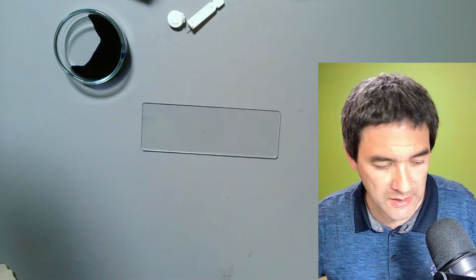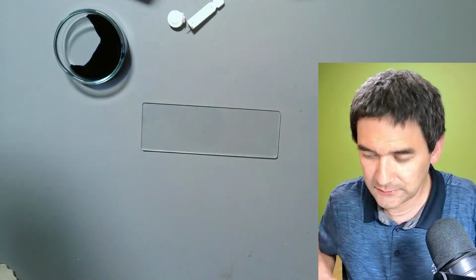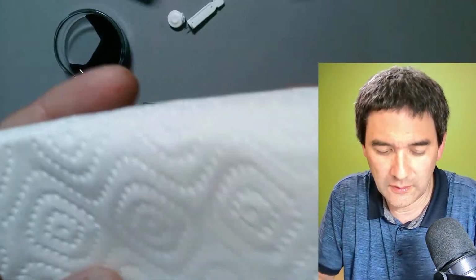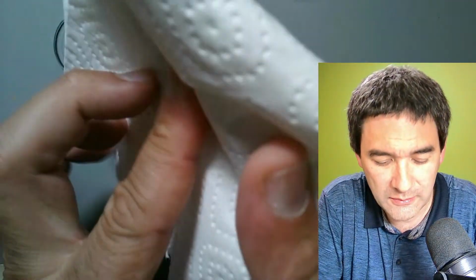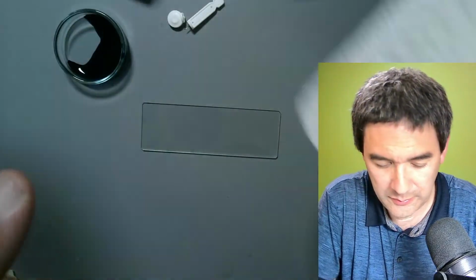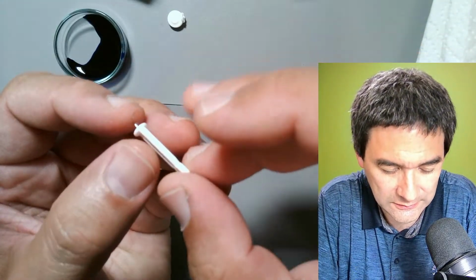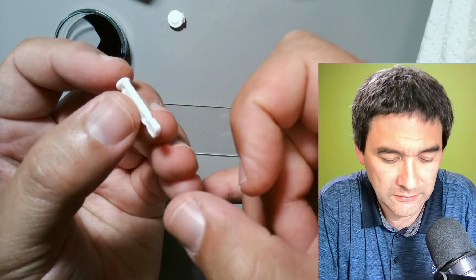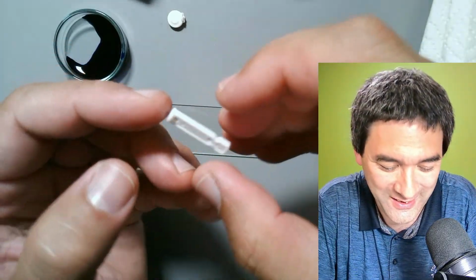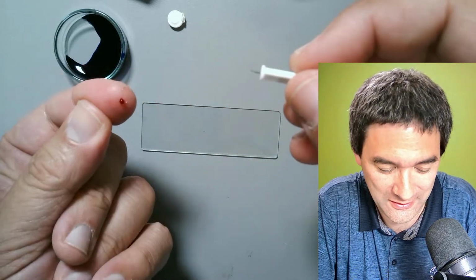So this basically means, again, I will use some tissue paper to disinfect myself a little bit. So let's take this here again. It's easier actually flicking your finger than trying to push it in. Psychology again, you know. This also worked fine.